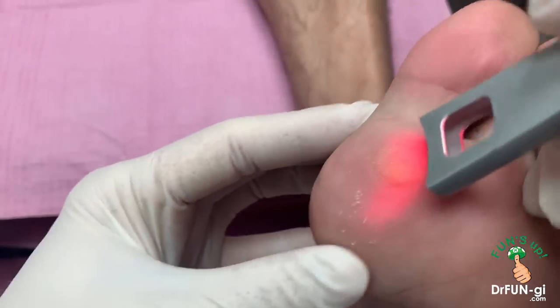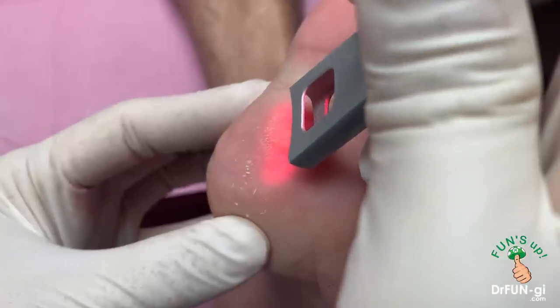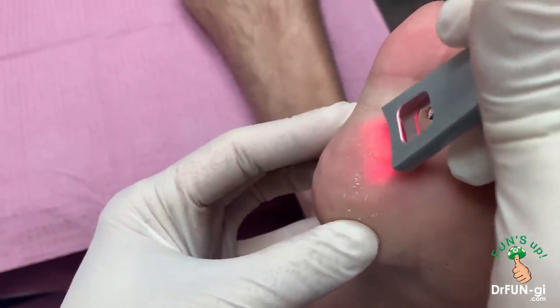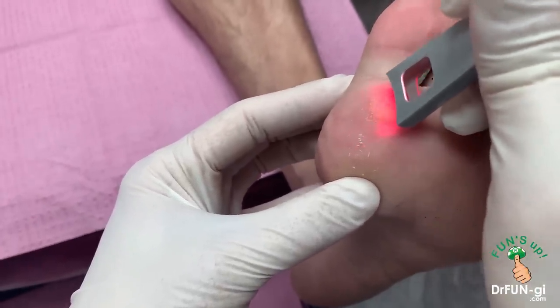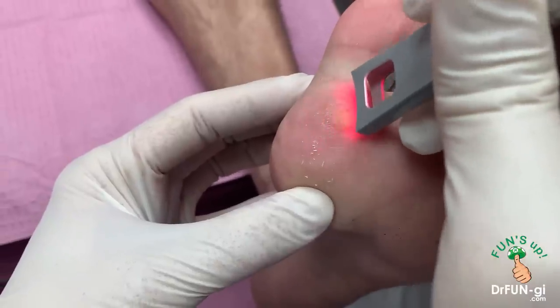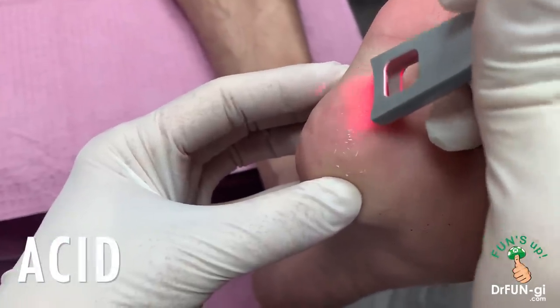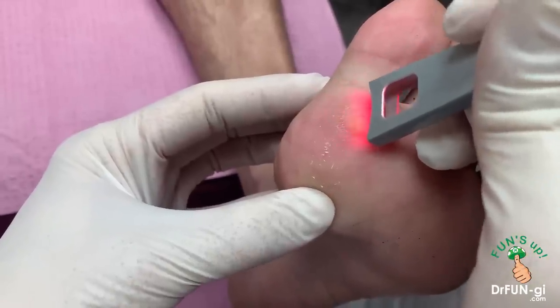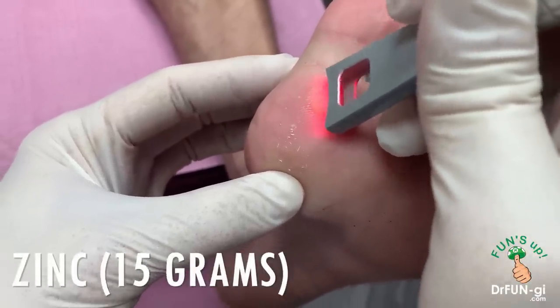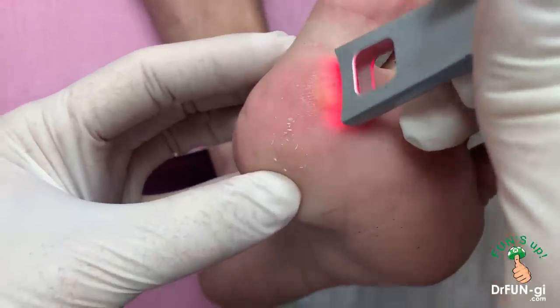So we have this laser machine. It's going to get a little bit hot — you just let me know when it gets too hot. Heat is very effective to kill anything that grows in your body. We're going to heat it up to make the environment a little difficult for the virus to continue growing. And then we're going to put some acid on there and some duct tape. Also, your immune system needs to improve, so I'm going to recommend high-dose vitamin A — about 10,000 international units — and 15 milligrams of zinc, which really helps your immune system to kill this virus as well. So go to the pharmacy and pick up those things.